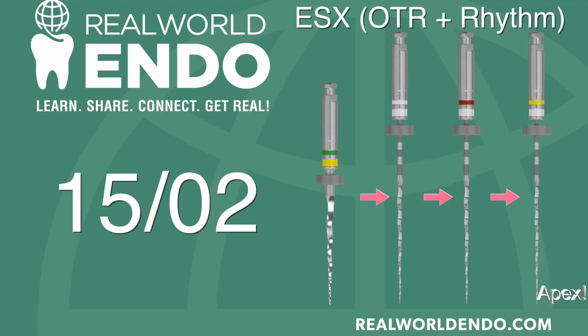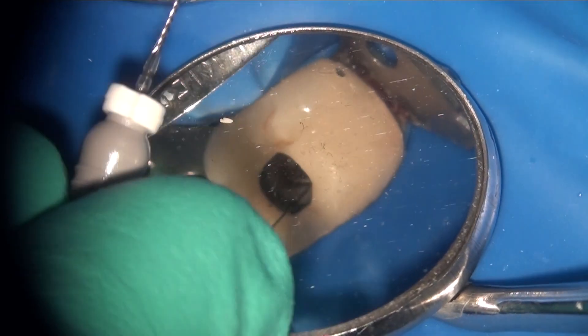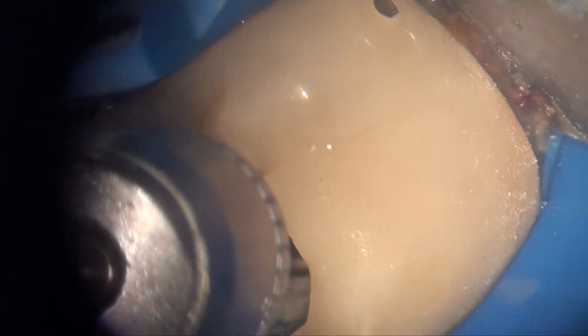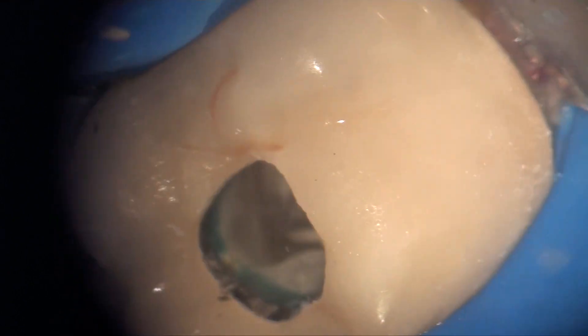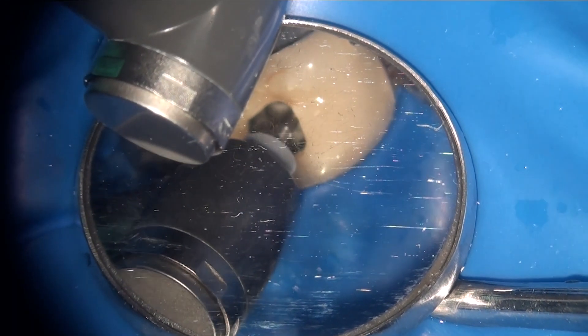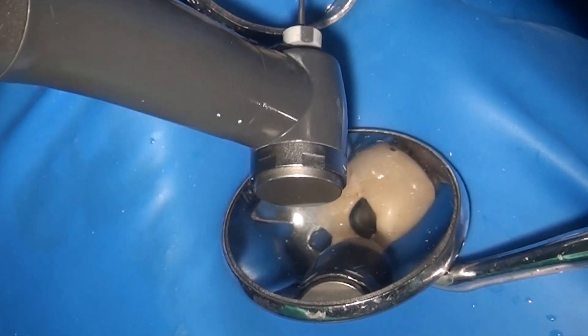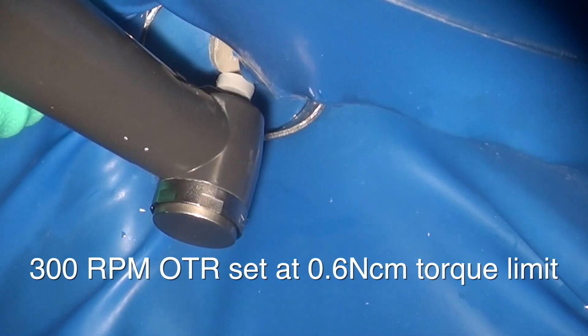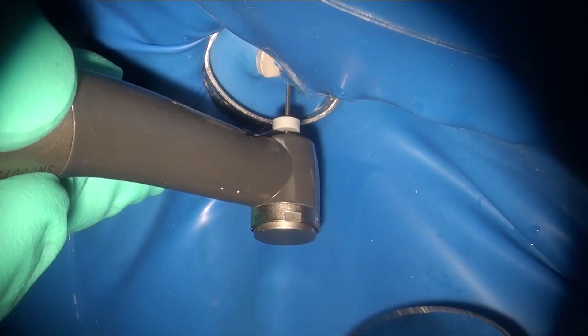Now that the upper one-third of the canal was opened up, it was time to start using hybridization of tapers, a technique described in a previous video. The available length was determined with a small stiff file, then followed by a sequence of files with the same size tip but with decreasing taper. After the orifice opener and determining available length, I went from a size 15/05 down to a 15/04 followed by the 15/02. These files were used in the rhythm motion on the endosync with OTR at 300 RPM and an OTR setting of 0.6 newton centimeters. All instrumentation was done at this speed and OTR setting from beginning to end. I then connected the endosync to the endosync AI to measure working length using the 15/02 ESX scout file.